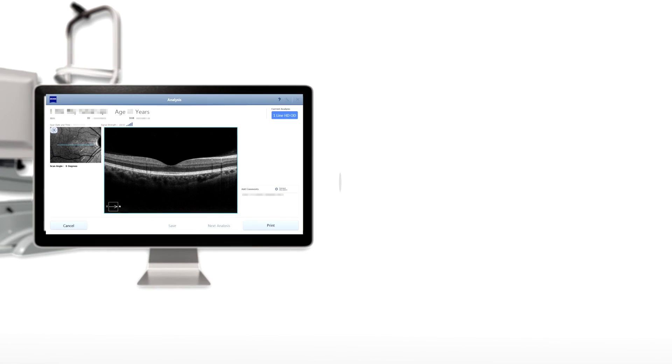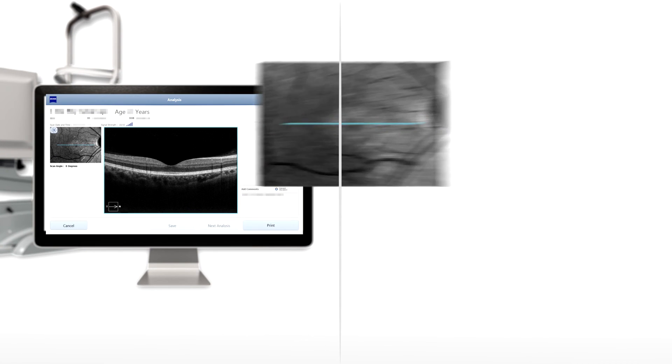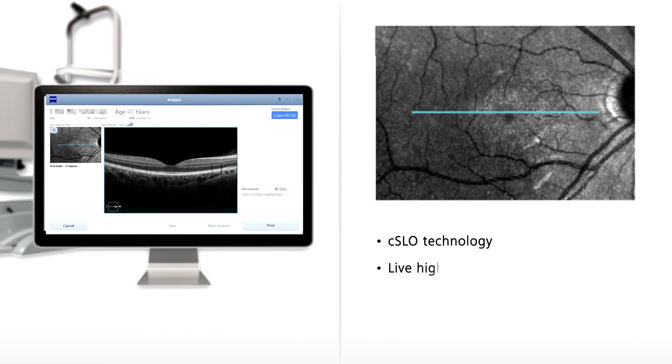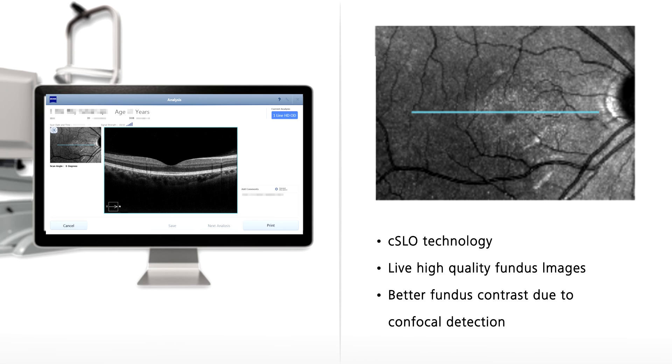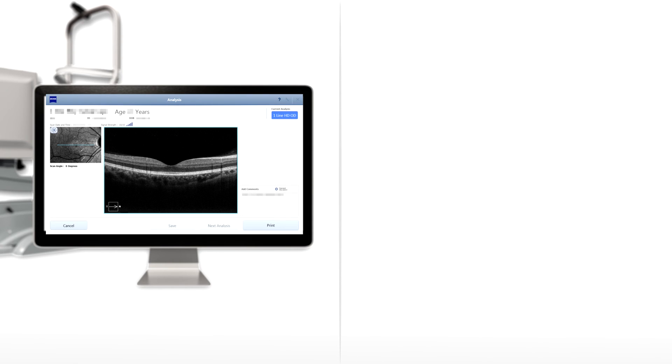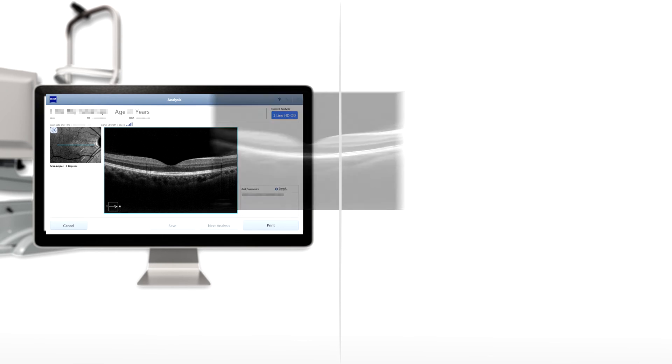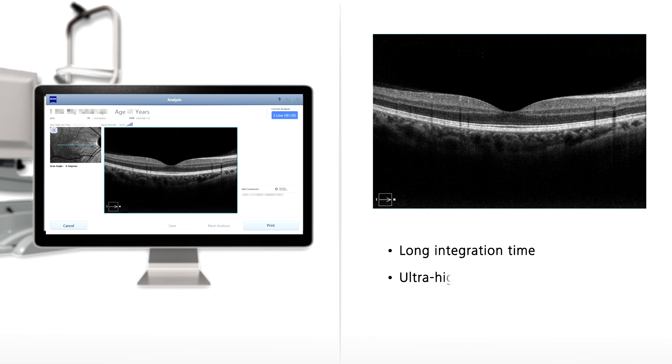See in greater detail, even in deeper eye tissues such as choroid layers.